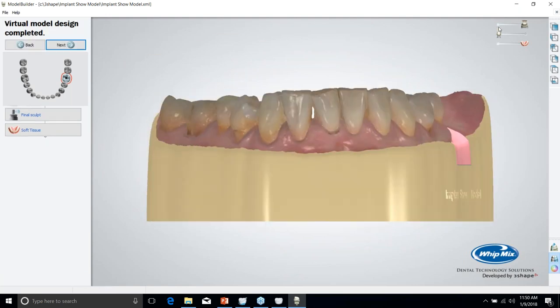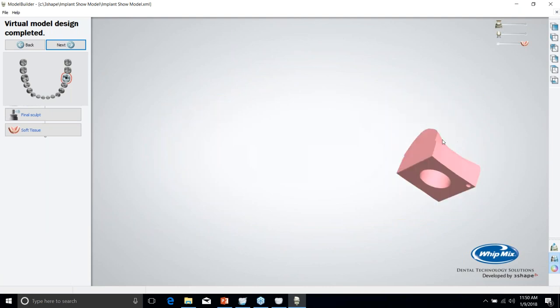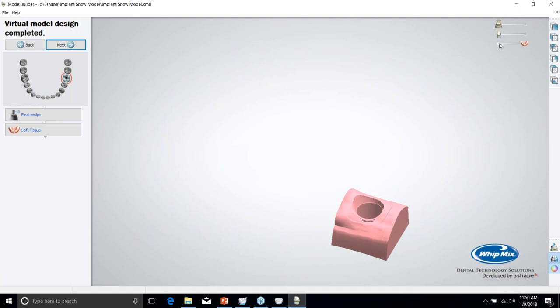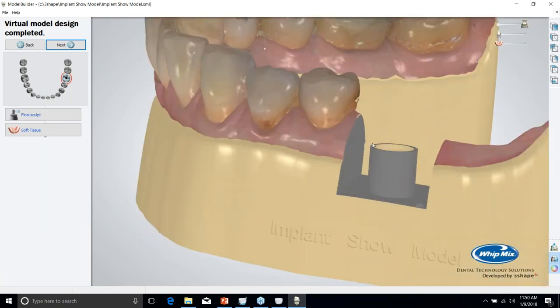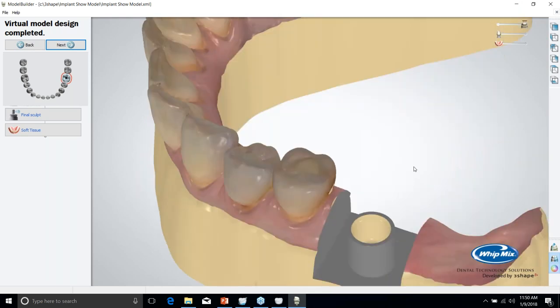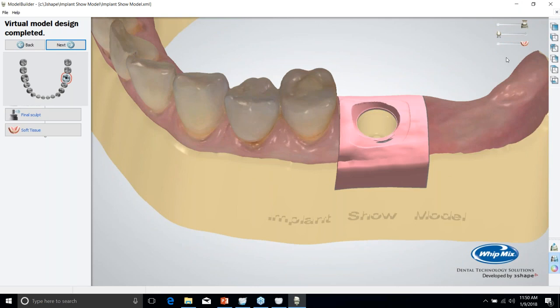So now if we look at the tissue piece, there's that little fixture that it adds. And then if we look at the model, you can see it's added this cylinder to protect that analog and give it its full support. And then there's the two together.